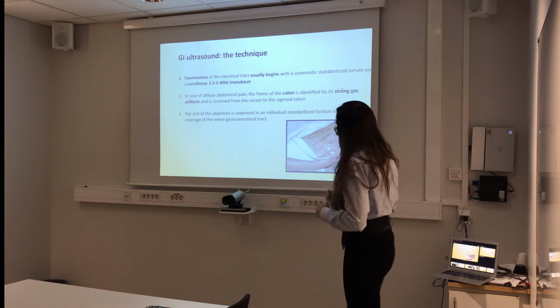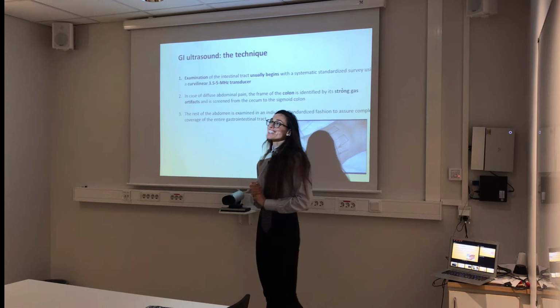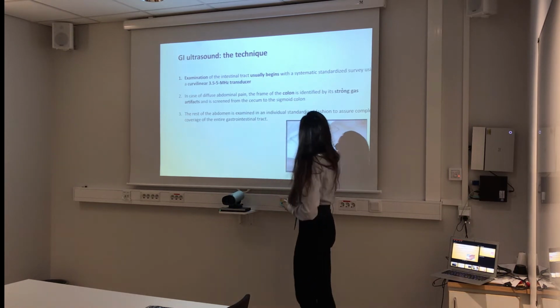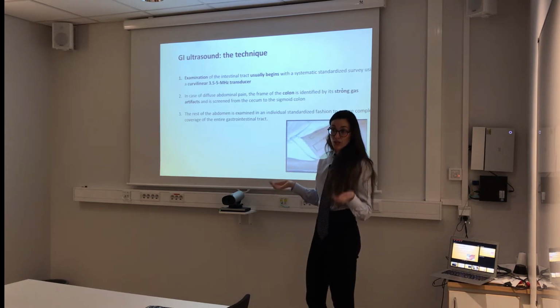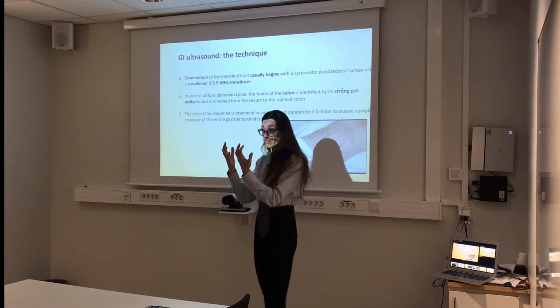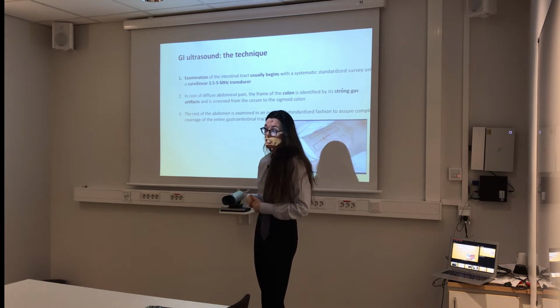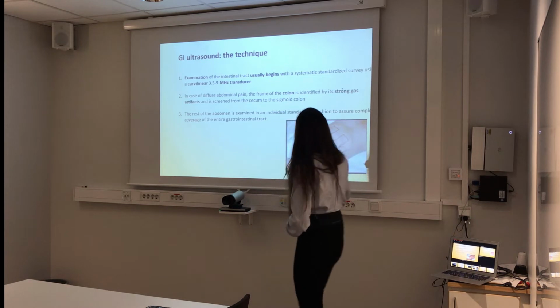So the techniques first. There are two techniques. I always say that the best thing to start with is using a convex, basically an ordinary abdominal probe. So the convex, the abdominal one, the big one, that does have the low frequency and more penetration to have just a look all over the abdomen. How do you do it?